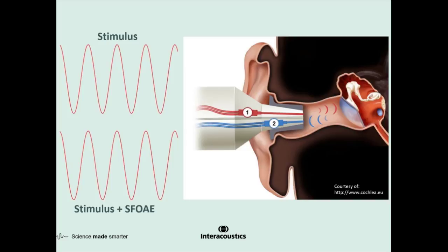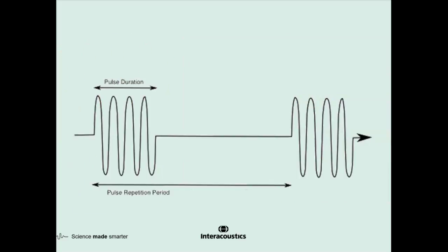So what can we do to make a more reliable measurement of this emission? And this diagram shows actually one of the tricks. Now, fortunately, it's a non-intuitive property of the cochlea, but the travelling wave actually travels more slowly in the cochlea than you would imagine. So normally sound travels at about 30 centimeters in a millisecond. Now, in the cochlea, after 1 millisecond, the travelling wave has barely started its journey to the apex. And so this slowing down of the sound in the ear canal gives us the opportunity to measure the emission after a surprisingly long period of time.